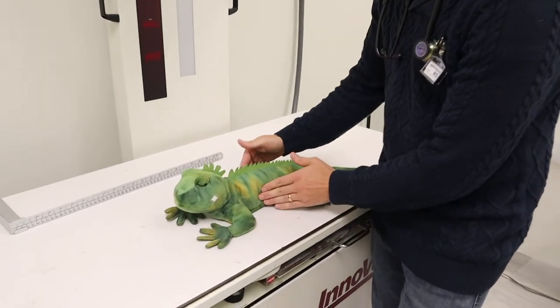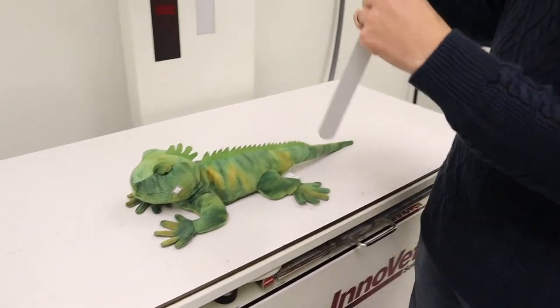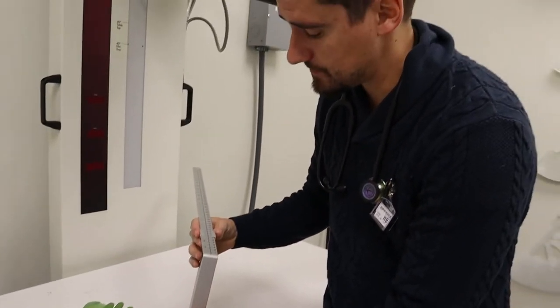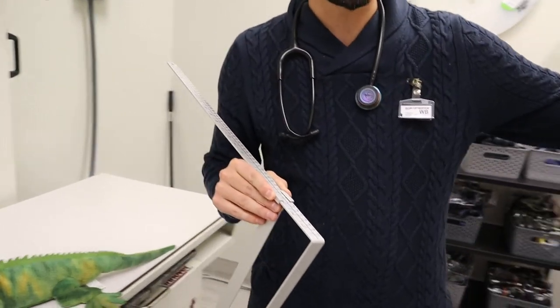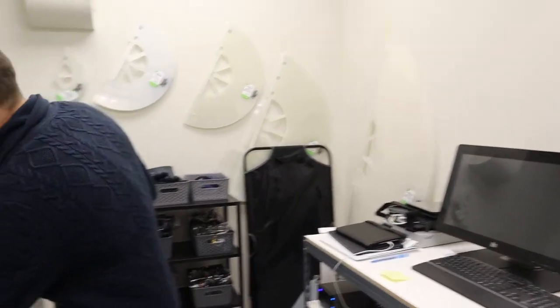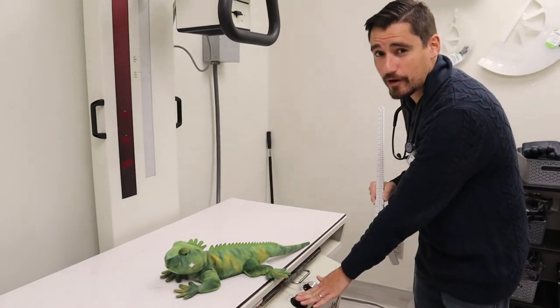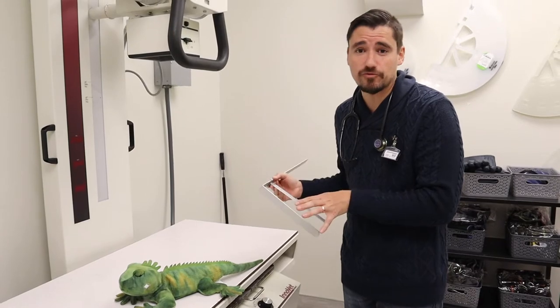Today, we're going to say that we have a belly problem — our belly hurts. So what we're going to do is use this little tool here to measure how big his belly is. Remember guys, we don't want to overexpose our patient. We measured him and we're going to call him an eight. We come back to our computer, put in that he measures an eight, and that allows me to go to my x-ray machine and pick how much KVP and how much MA to use.